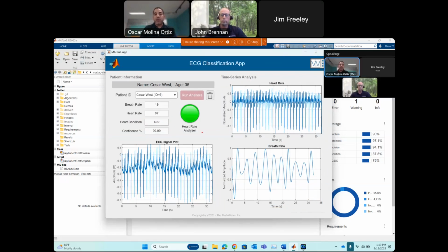Like even if we think about this light bulb over here, or this icon, or even the patient information box, there are some things that we need to pay attention to and treat accordingly when we are developing this software. And I'm going to show you what that is step by step and how MATLAB Test fits into the picture of maintaining such a complex software application.